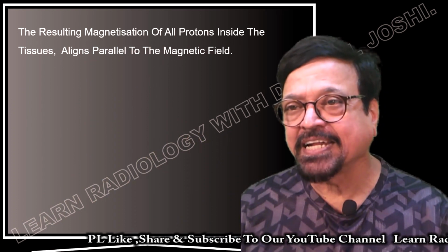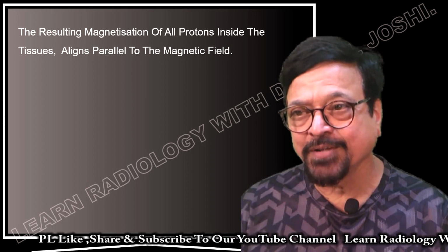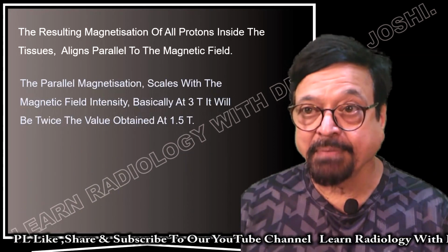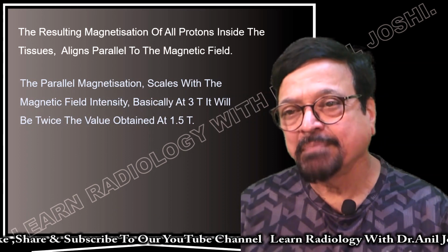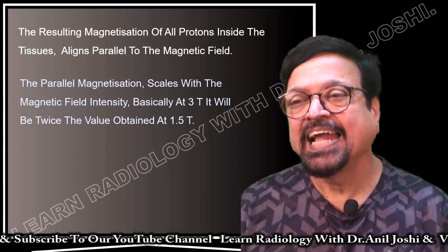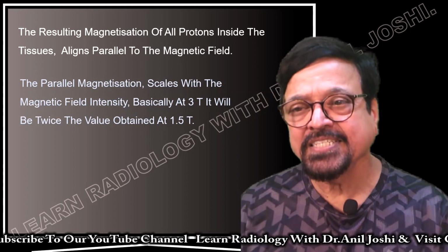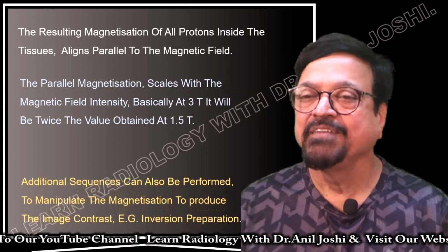The resulting magnetization of all protons inside the tissues aligns parallel to the magnetic field. The parallel magnetization scales with the magnetic field intensity. Therefore, a 3T scanner will have twice the values obtained from 1.5 T.